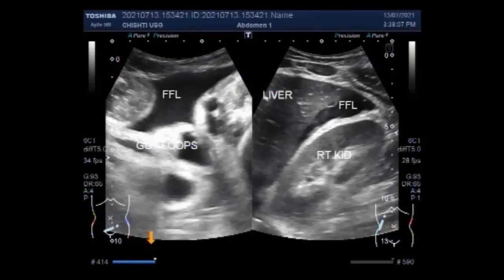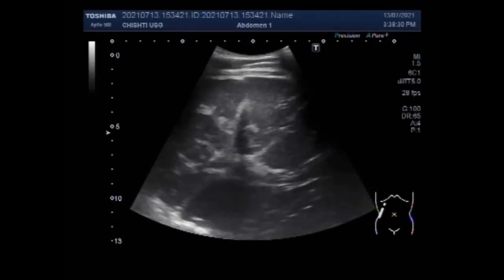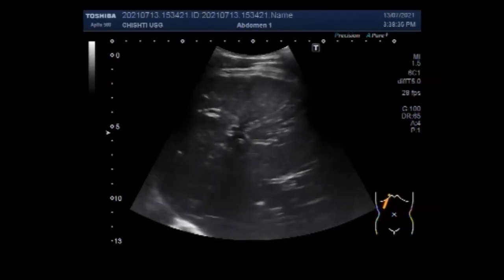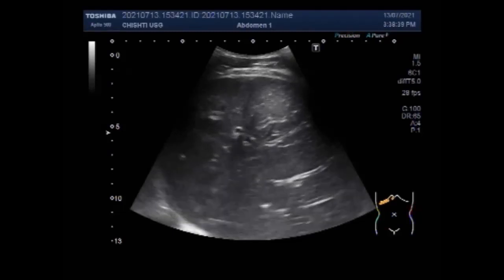This ultrasound video shows a case of intestinal perforation with localization of the ruptured area. Intestinal perforation, defined as loss of continuity of the bowel wall, is a potentially devastating complication that may result from a variety of disease processes. Common causes of perforation include trauma, instrumentation, inflammation, infection, malignancy, ischemia, and obstruction.